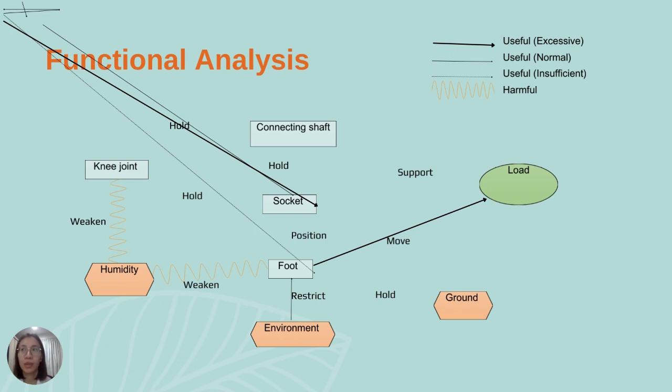And the foot component interacts directly with the ground and provides stability, shock absorption, and propulsion during walking and other activities. So the foot design should consider the environmental conditions to ensure its durability and provide optimal support.